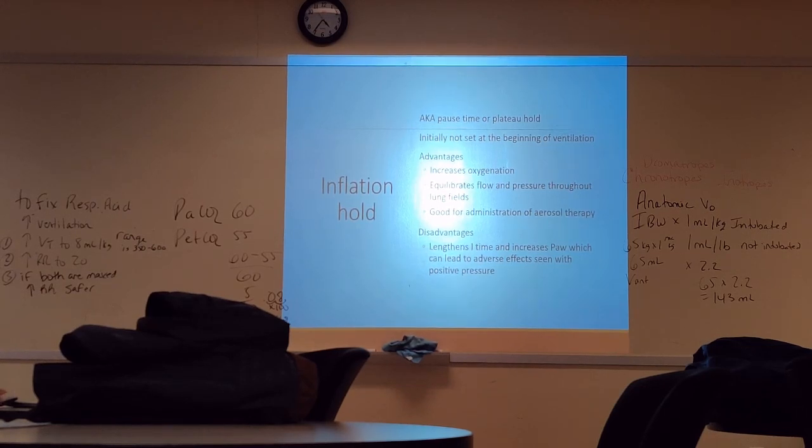Now, if you're going to leave your plateau pause built into the system, like on the Servo for volume ventilation, it lives there at 0.4 seconds, okay? The reason for it is to help recruit alveoli and to increase oxygenation. That's the purpose. And for people out of post-op, that's a great thing to do. But the second somebody starts to wake up, they're not going to appreciate you doing that anymore. So you need to take it away.